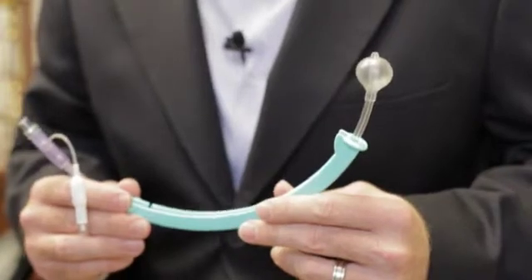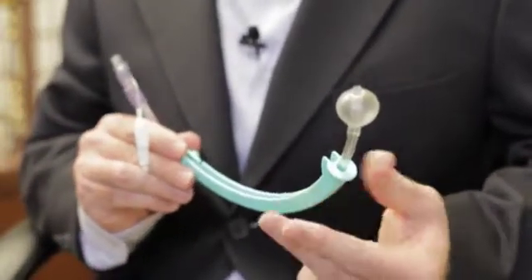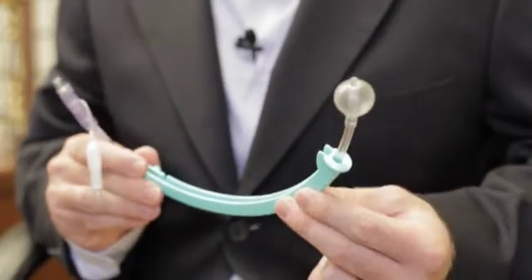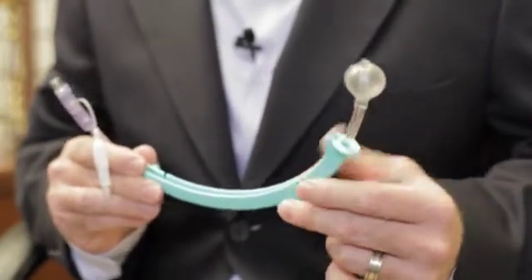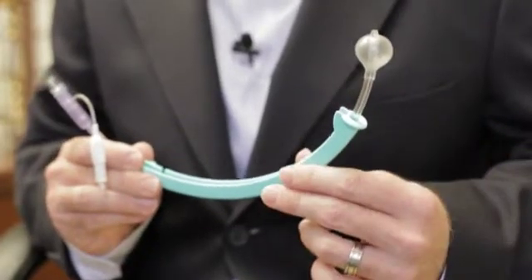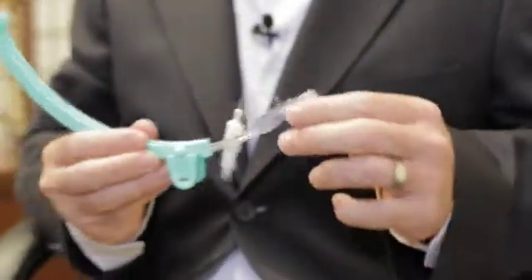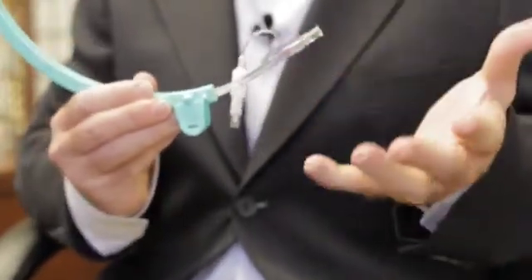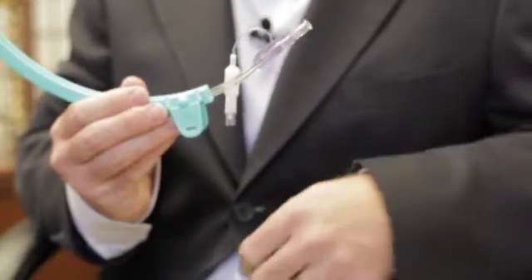Let me show you how it's different. We have a pear-shaped balloon, and this helps prevent leakage during injection. We have a shorter, smoother distal tip, and this helps reduce uterine perforations and increases patient comfort. We also have a flexible connector that physicians absolutely love — this helps prevent breaks and gives the physician more flexibility during the procedure.